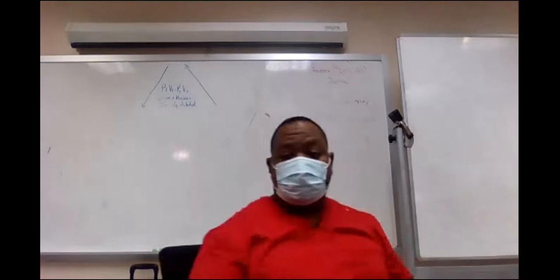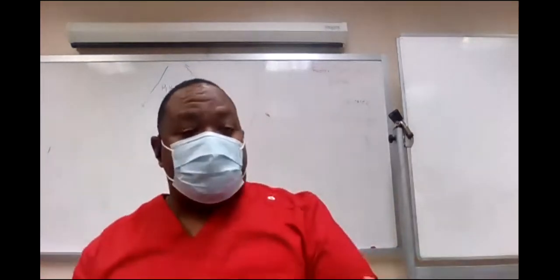All right, so let's take a break, and we'll come back to showing you some of these high flow devices, starting with the Venturi Mask. The Venturi Mask is the first one we're going to learn about, which is based off the principle of air entrainment.